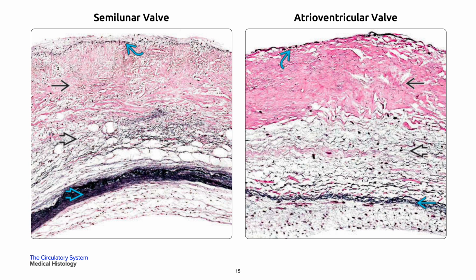On your left are the three distinct valvular layers: the fibrosa in a single black arrow, the spongiosa in a bold black arrow, and the ventricularis in a bold blue arrow. A fine line of elastic tissue is seen beneath the endocardium, overlying the fibrosa layer, in a curved blue arrow. The ventricularis layer is the richest in elastic tissue, as shown by the heavy black band on this elastic stain.